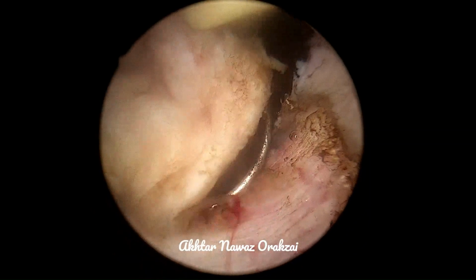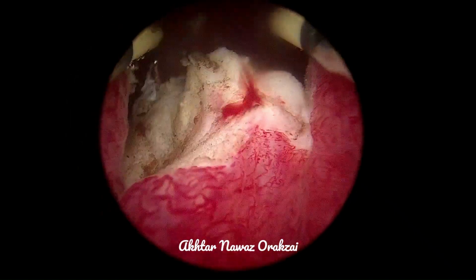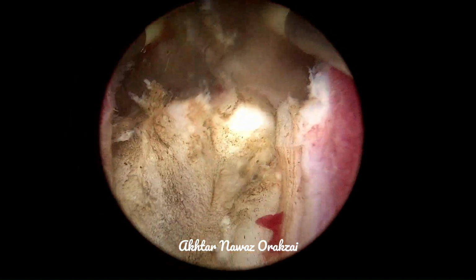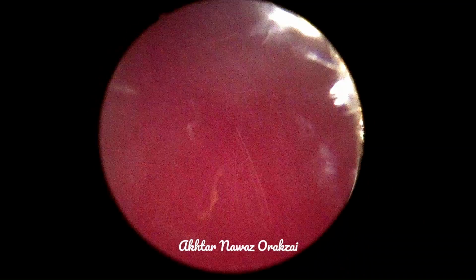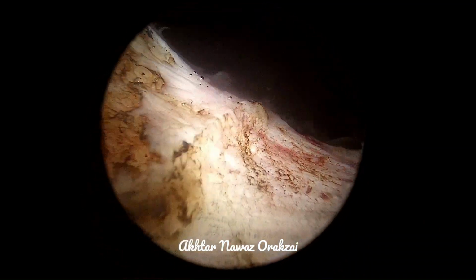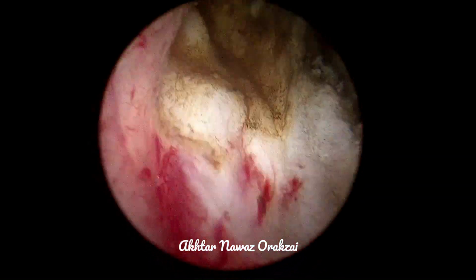So control the bleed or the active bleeders before you go on to resect a new area. You can see the bladder neck fibers here, so the median lobe resection for the moment is complete.